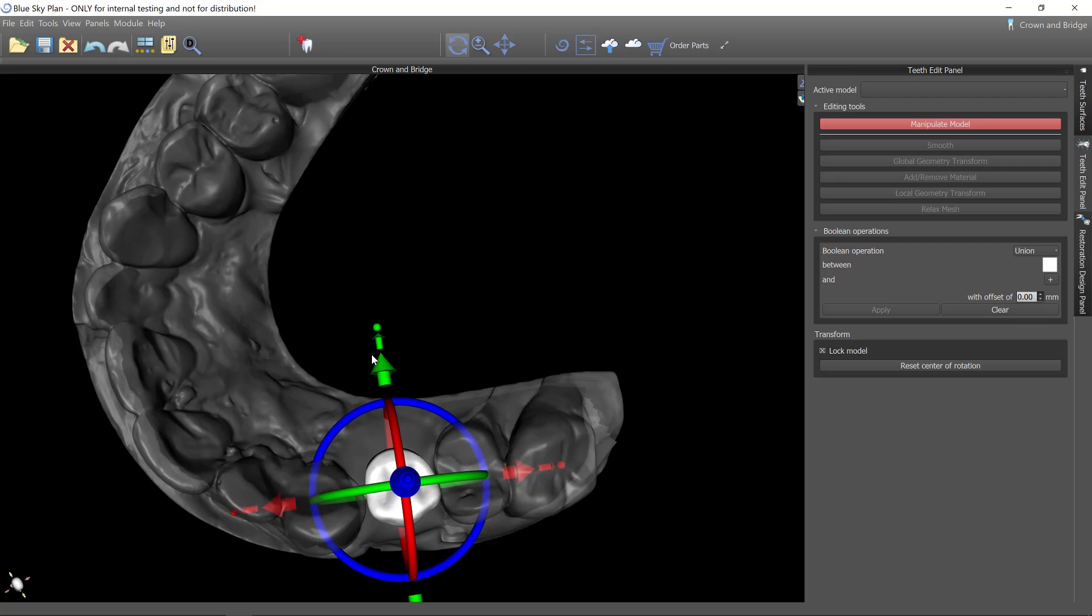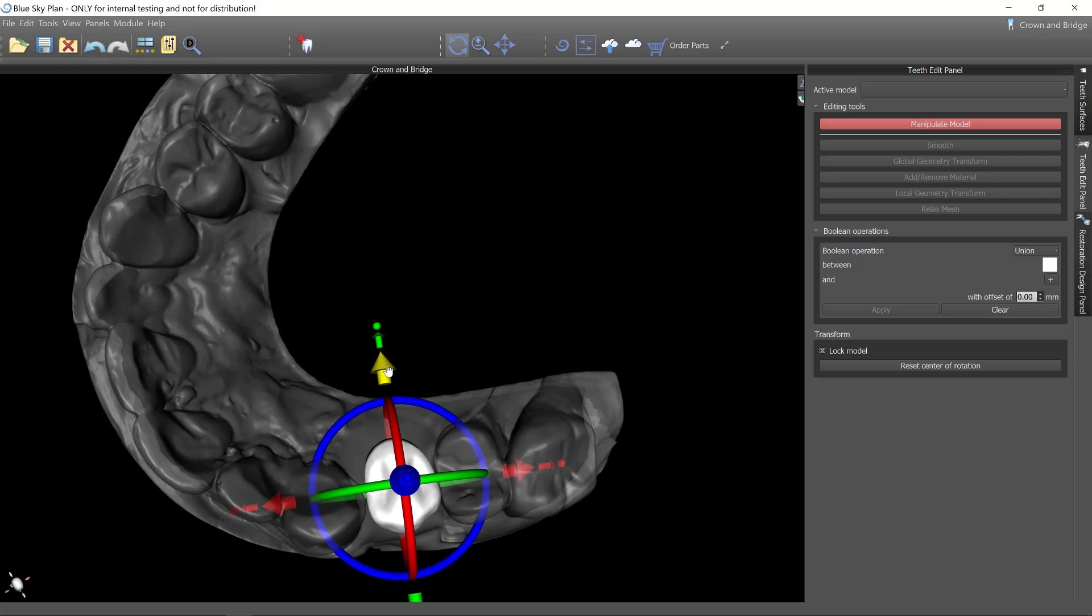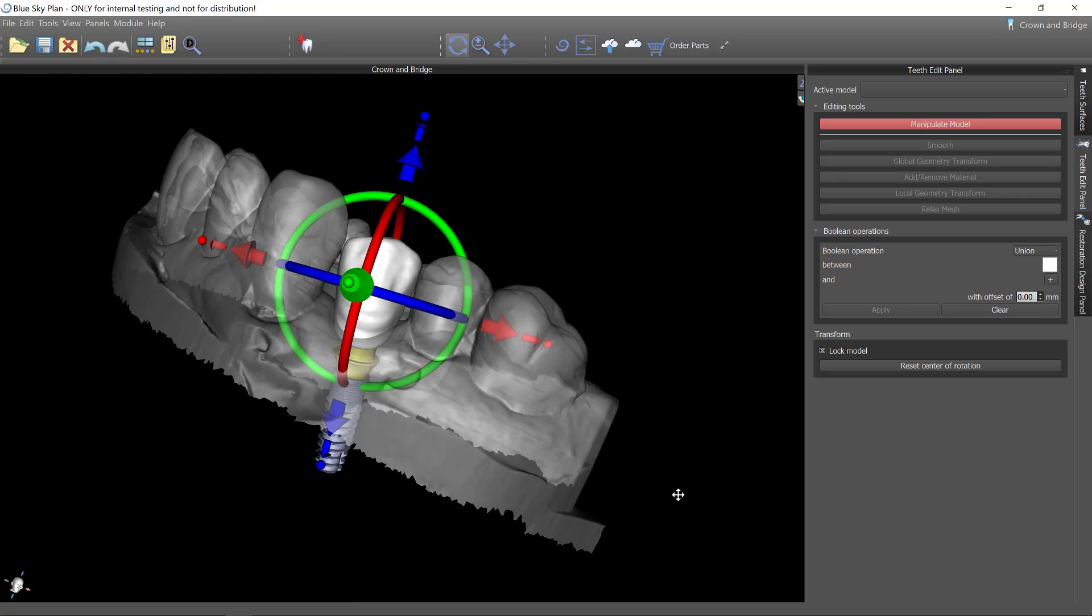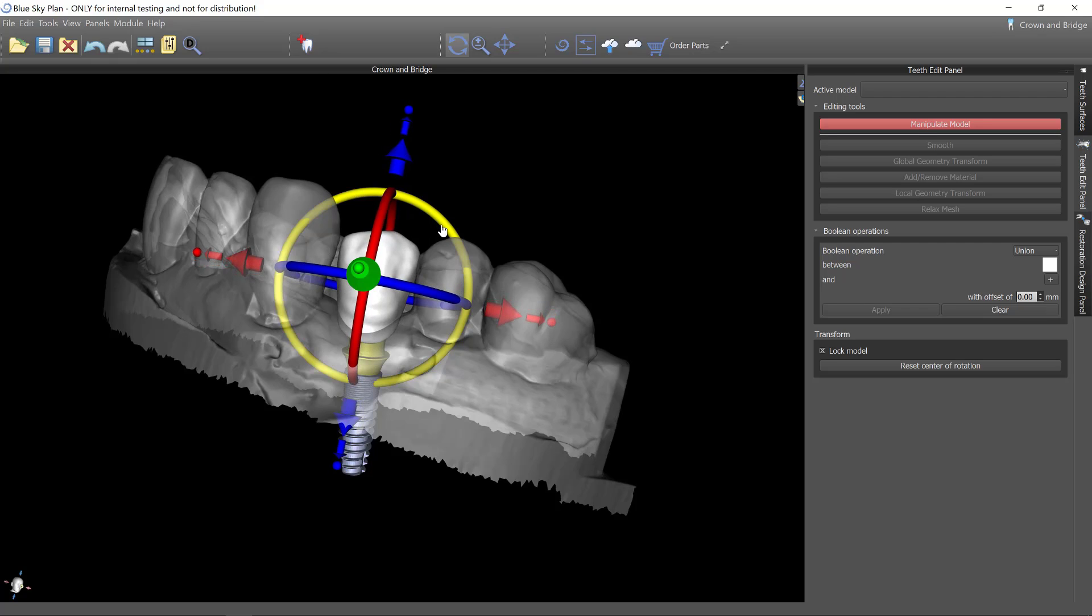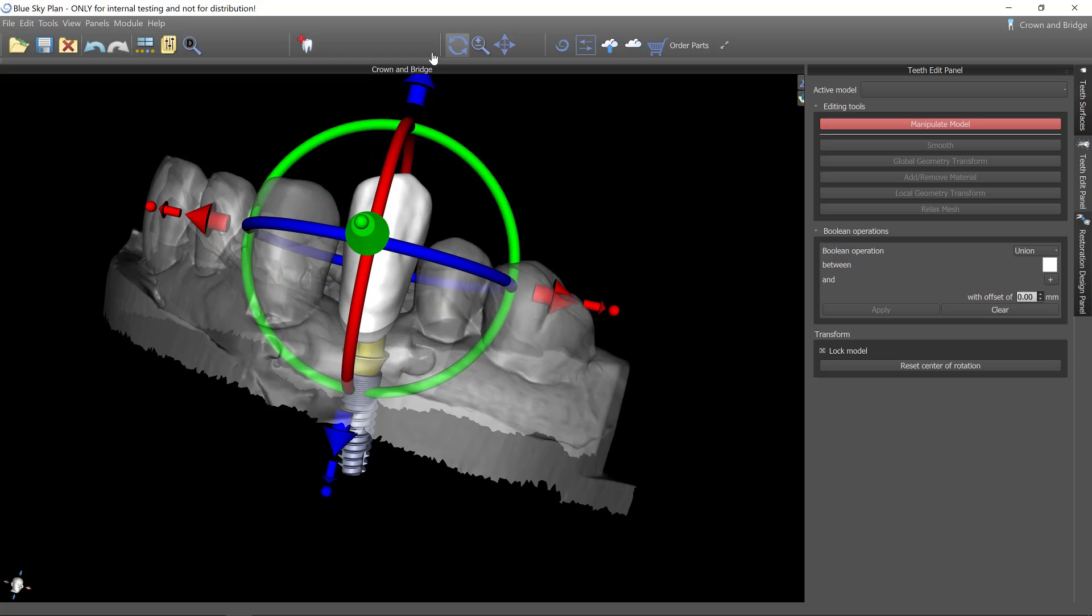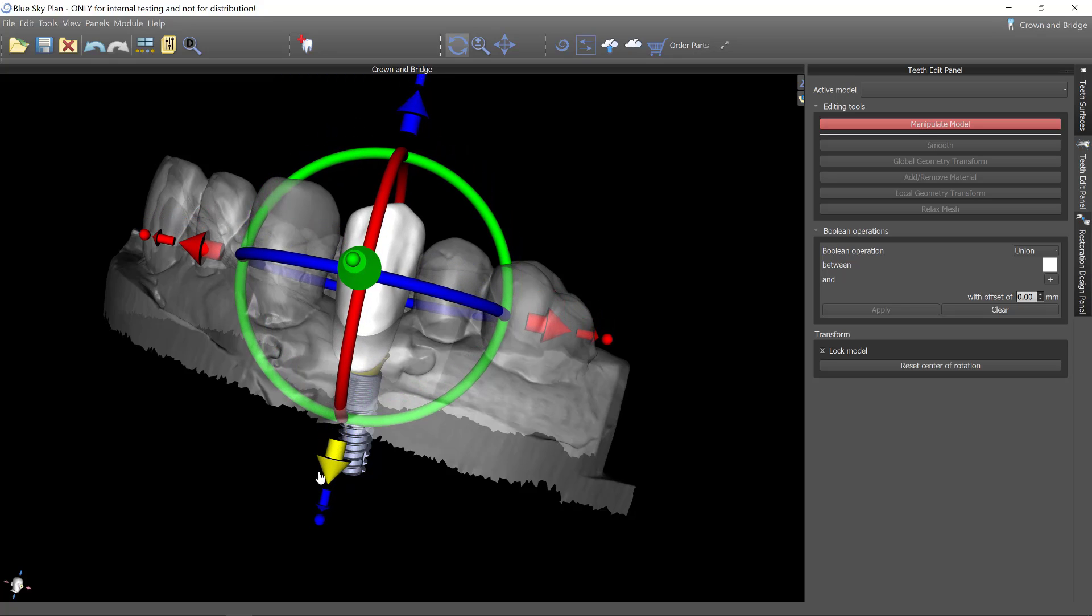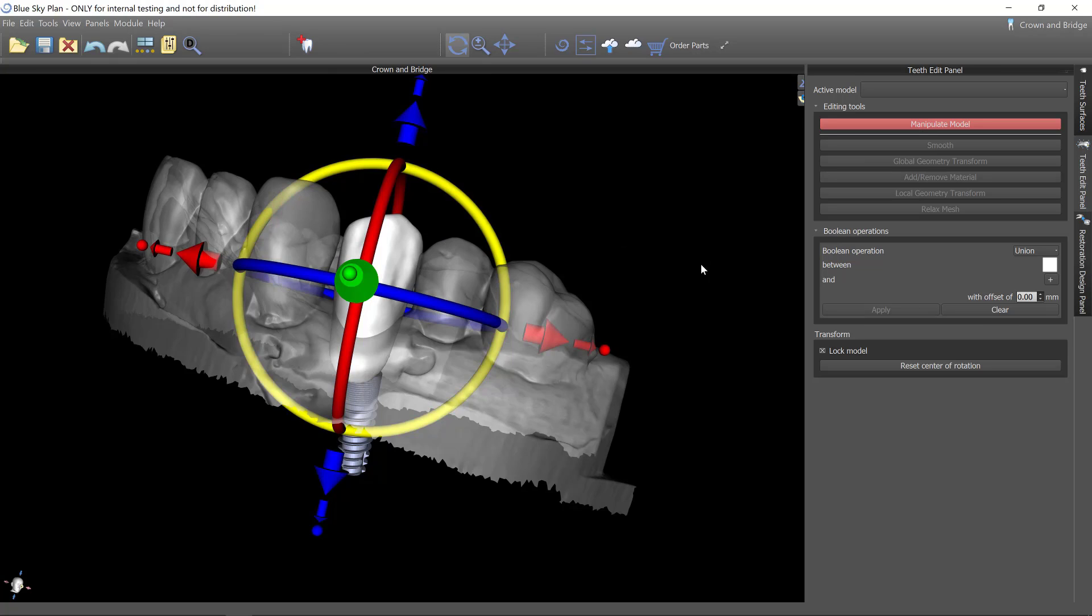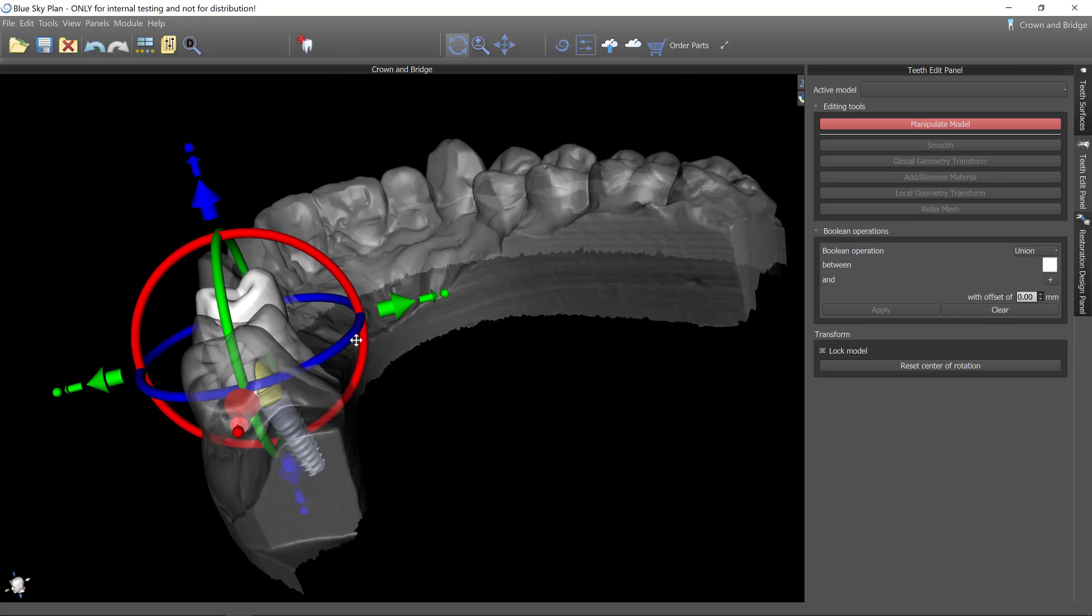That's good on mesial distal width. Now we want to look at buccal lingual width. Stretch that as well so that it's roughly the same size as its neighboring tooth. And then we want to get its rotation similar in all of the various axes. I can stretch this up quite a bit and then pull it down because I actually do want to create an intersection of where this bisects the model.